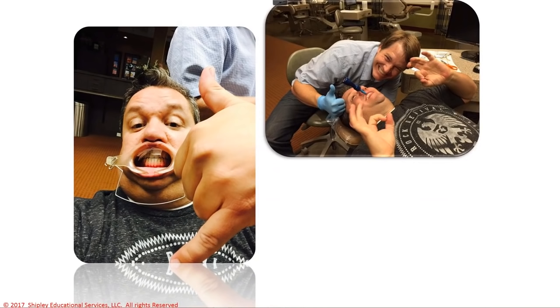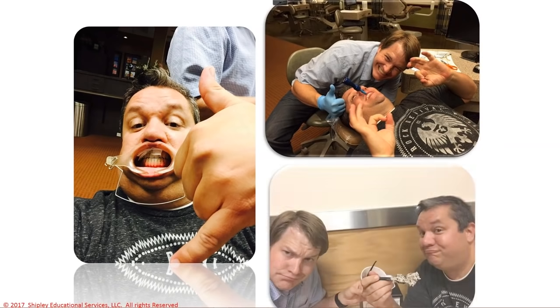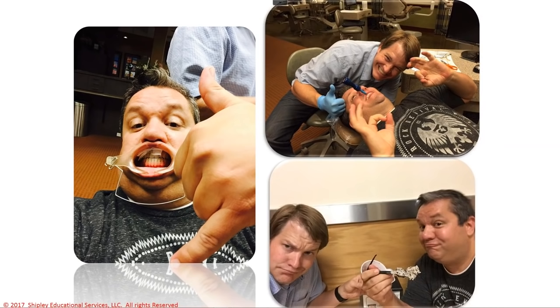We've got the driver stuck in there, a full 7 millimeters. I was able to get numb enough that I didn't feel a thing, even with it 7 millimeters. Remember, you only have to be 2 to 3 millimeters in bone, but we went ahead and did the full 7. I didn't feel a thing here. We even let go of the device, and I didn't feel a thing. So if you're methodical, you can get good anesthesia. An hour later, we were eating ice cream, and I was feeling just fine.